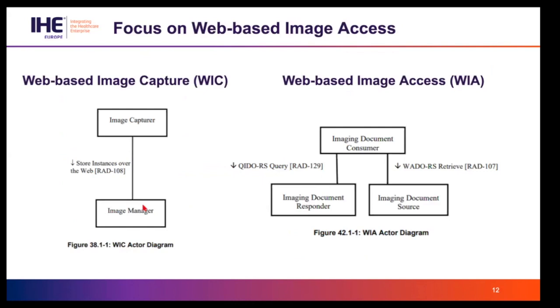And to go quickly through where our focus is. One, as we mentioned, is web-based access to images. The two profiles that I just mentioned have been in final text. They are based on the DICOMweb RESTful web services definitions, and have been in wide use already for quite a while. So all the vendors who want to utilize this newer paradigm are encouraged to come to the Connectathon and test it. Next slide.